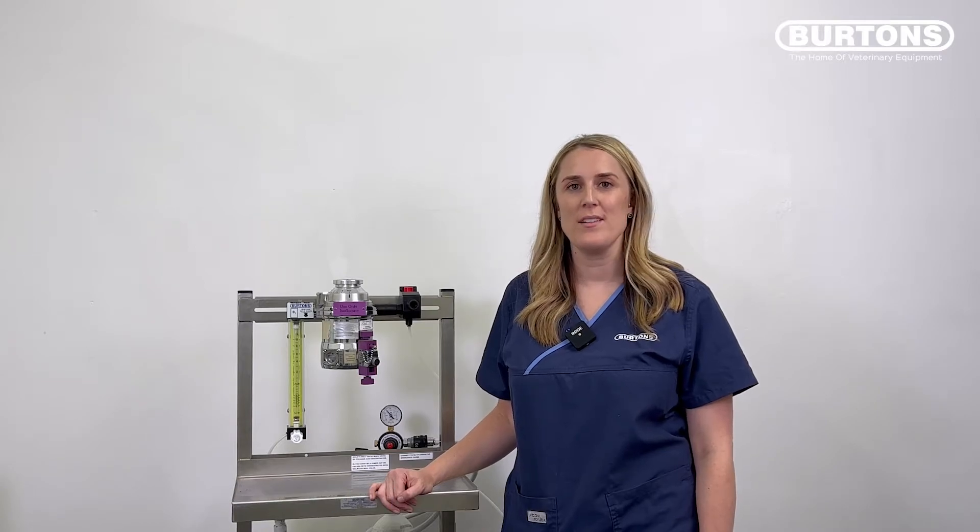Hi, I'm Courtney, and in this series of clips, I'll be taking you through how to do leak tests on your anaesthetic machine and different re-breathing and non-re-breathing systems.